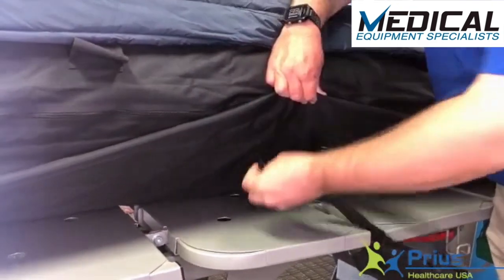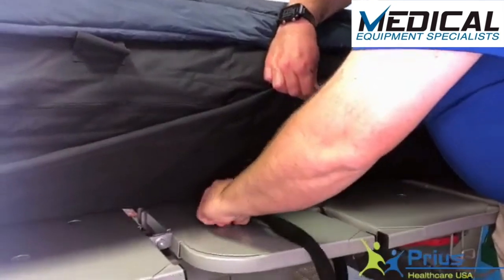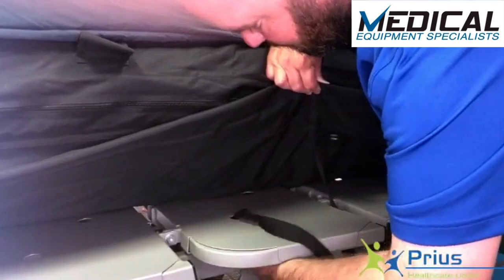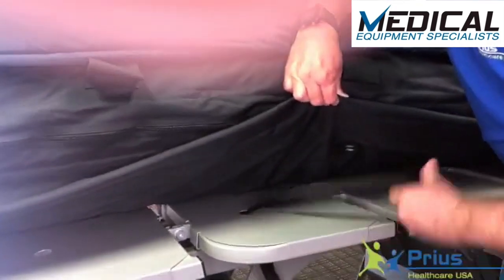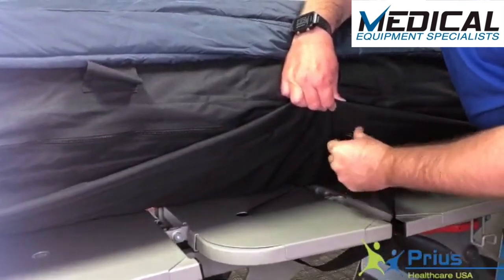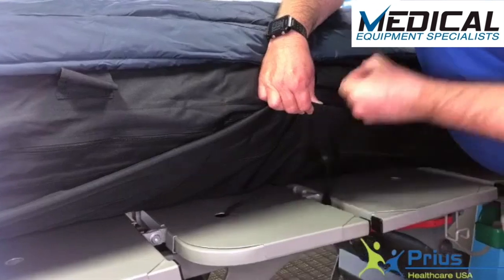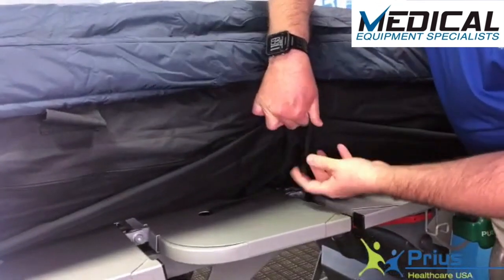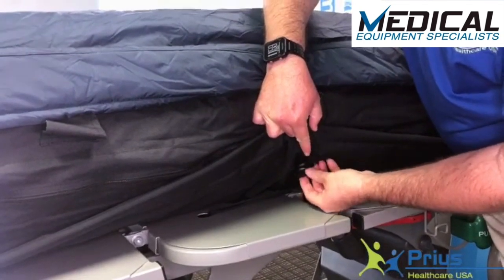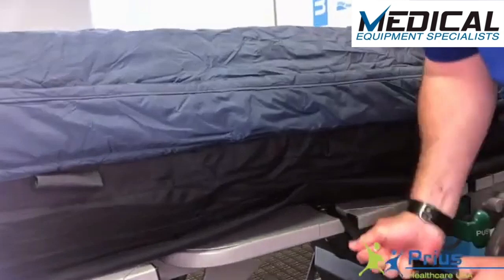To strap the mattress down to the bed frame, we have the 8 D-ring straps across the mattress. What you're going to want to do is take the strap itself, put it through somewhere on the moving part of the bed frame. Then take the strap, put it through both D-rings, put that trailing end through the second D-ring itself, pull it back through, and taut.